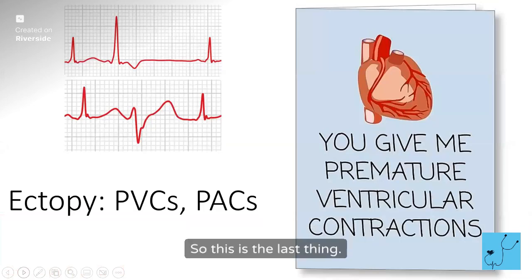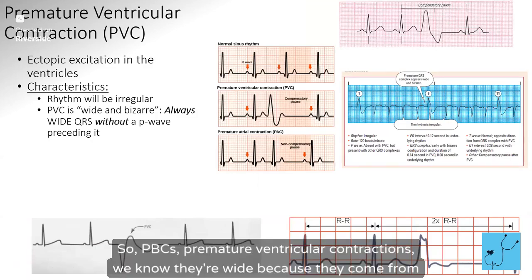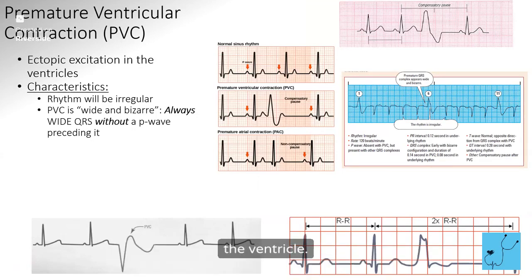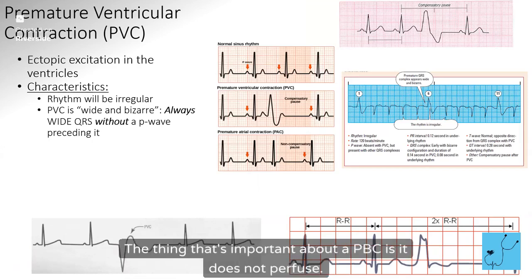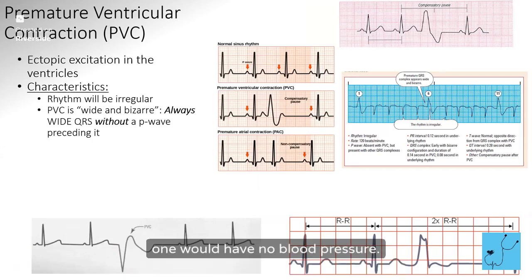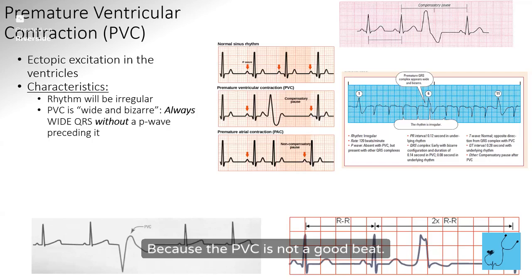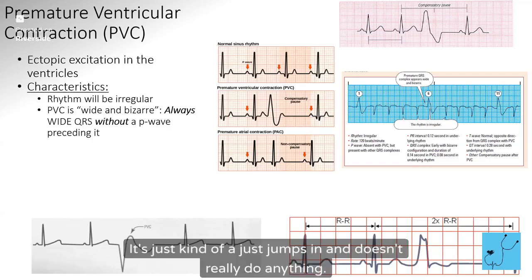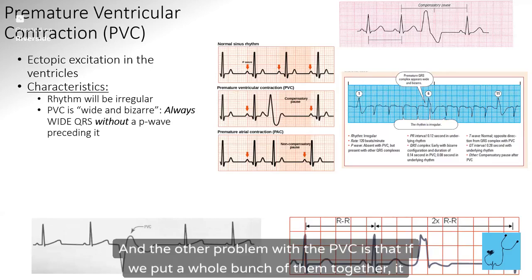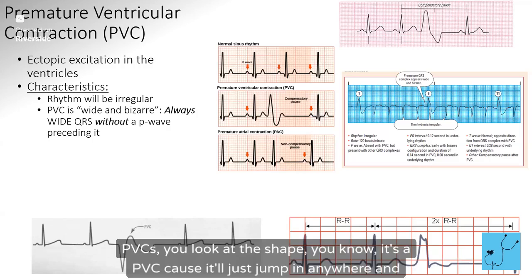Okay, so this is the last thing. PVCs, premature ventricular contractions. We know they're wide because they come from the ventricle. It just got excited and came in a little early. The important thing about a PVC is it does not perfuse. If I had an arterial line and could show you a blood pressure with every beat, this one would have no blood pressure. It would be blood pressure, no blood pressure, because the PVC is not a good beat. It just jumps in and doesn't really do anything. The other problem with the PVC is that if we put a whole bunch of them together, it turns into VTAC.